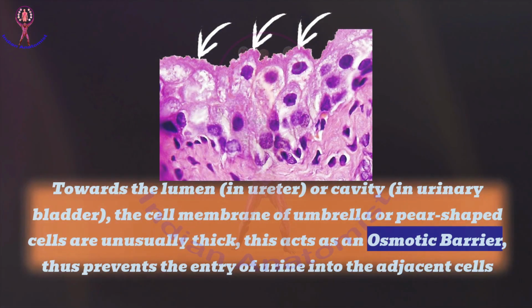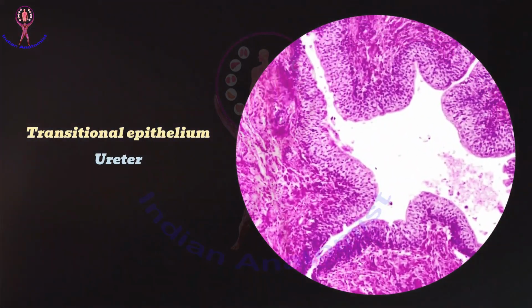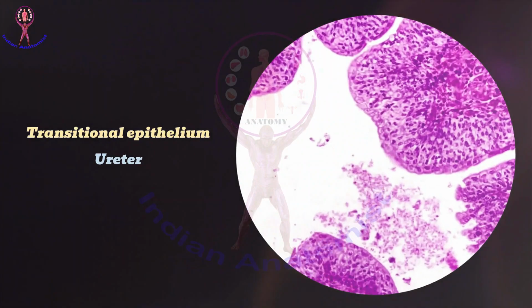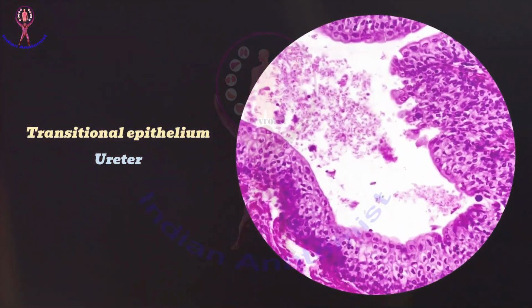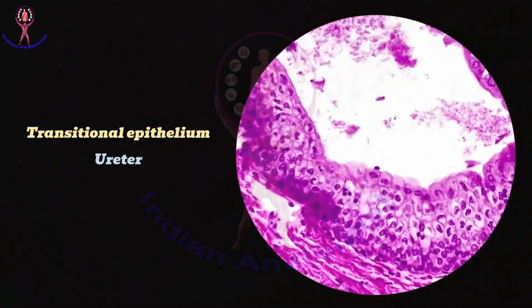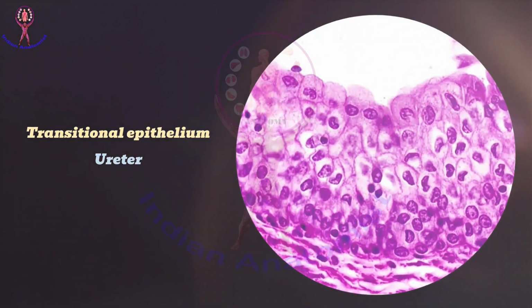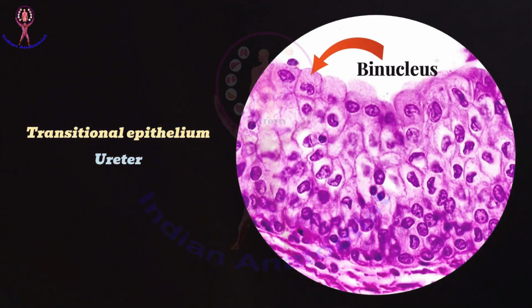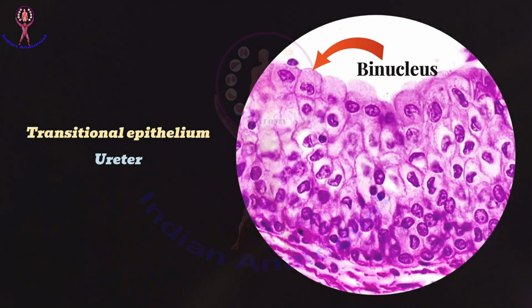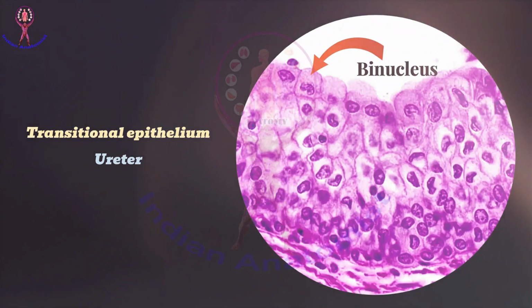This microscopic slide displays the human ureter at magnifications ranging from 5x to 40x. When viewed in greater detail, the ureter displays the transitional epithelium at its central cavity, which is depicted as a white region. The surface epithelium, known as umbrella cells, consists of a single layer of modified cuboidal cells with a centrally located spherical nucleus. At times, the cell may possess two nuclei.